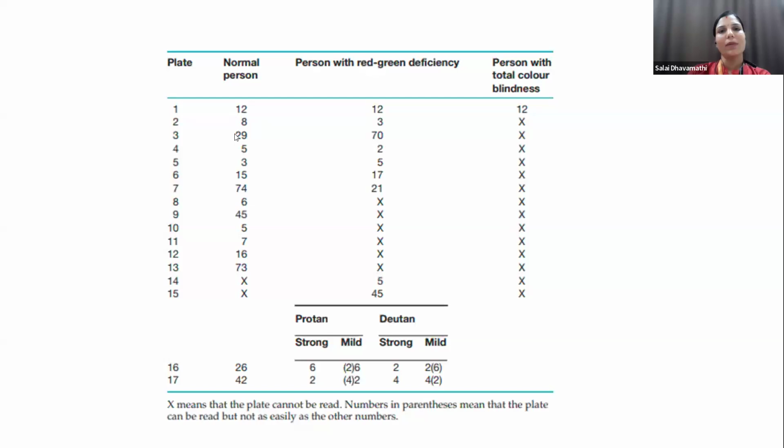She covered many things about pseudoisochromatic plates. I just wanted to ensure here, on the slide she has already shown, the luminance of the test. Luminance is very important. Usually we try to do it in daylight. Actually, a daylight simulator is required, but that is very expensive, so we cannot get it in all clinics. So at least we should try to keep 250 to 600 lux, or if it is in Kelvin, greater than 5000 Kelvin should be there for the color vision test.